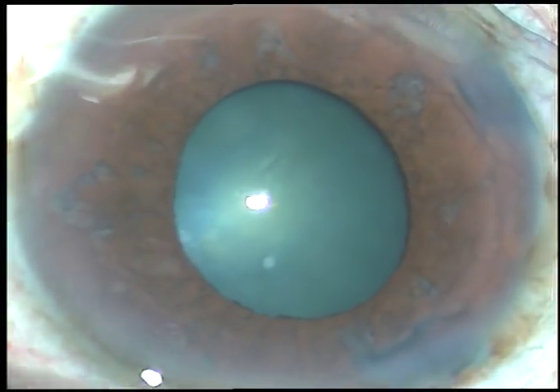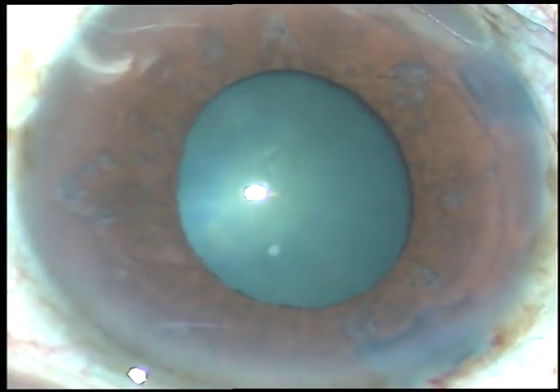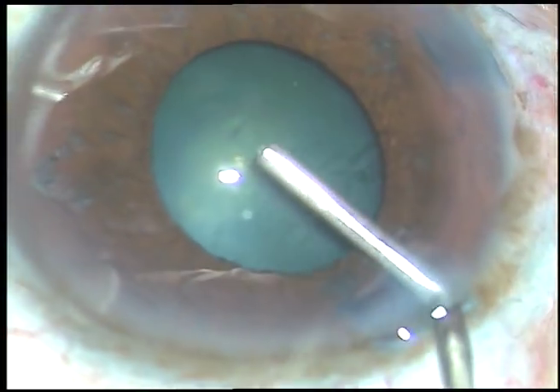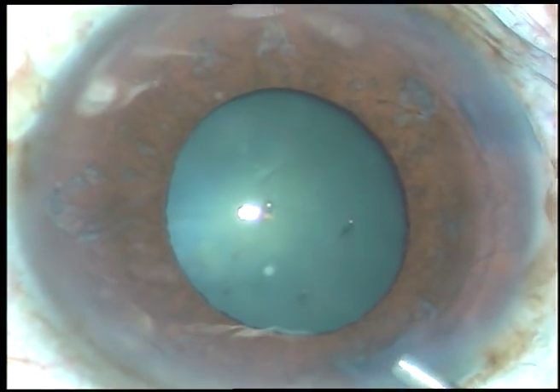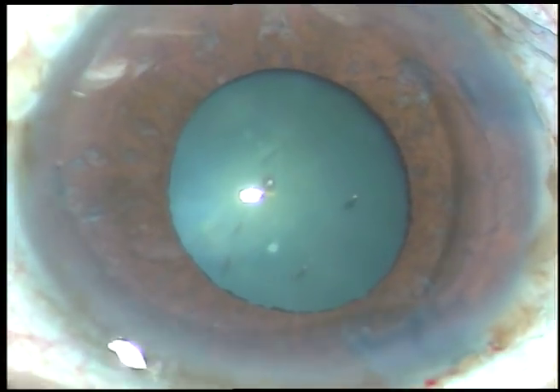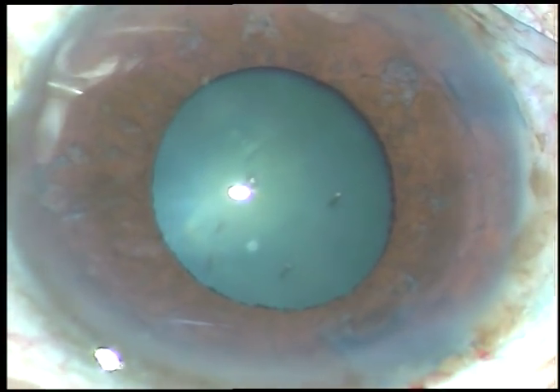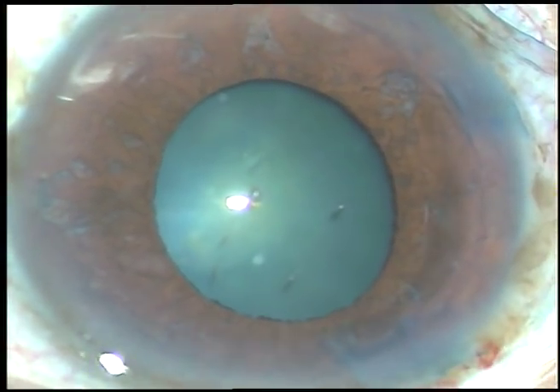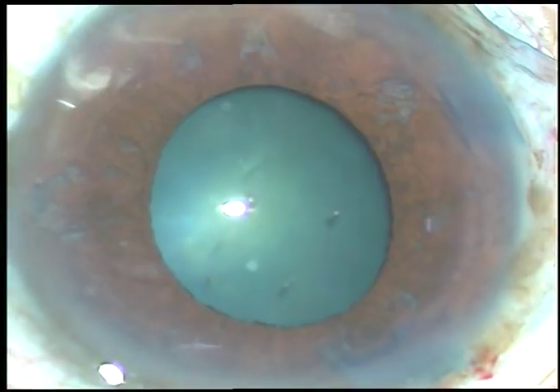So we have to use a pupil expansion device. The pupil expansion device which I like very much is the BX pupil expander. It is versatile, very slender, and very user friendly.